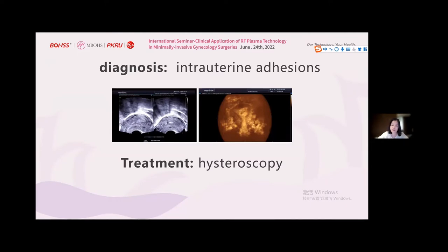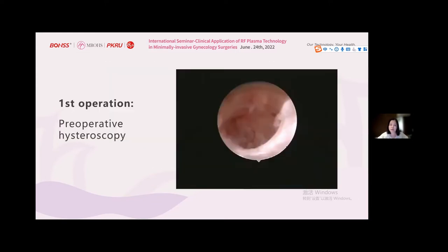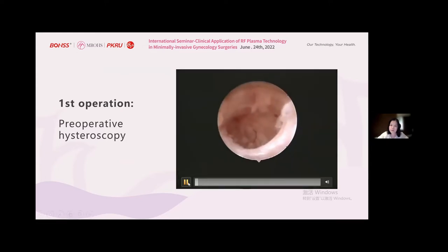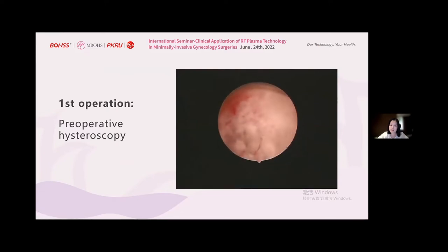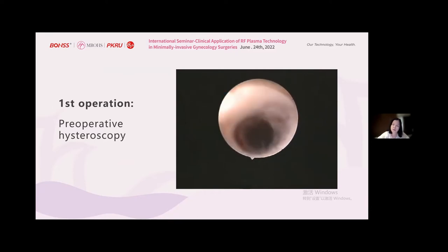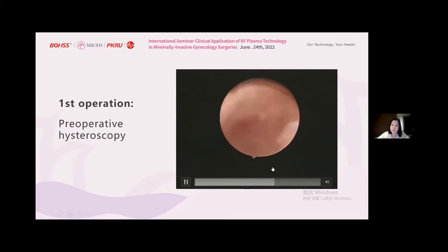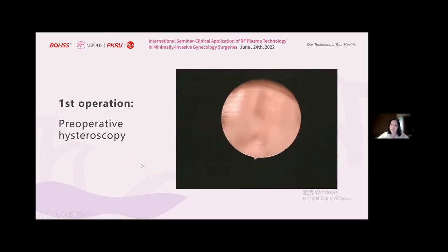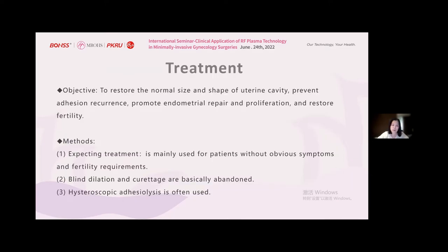Our treatment plan is hysteroscopy. In the first operation, we can see the uterine cavity is heavily adhered. The endometrium is thin and the bilateral fallopian tube openings are not visible. Through hysteroscopy, the treatment objective is to restore the normal size and shape of the uterine cavity, prevent adhesion recurrence, promote endometrial repair and proliferation, and restore fertility.